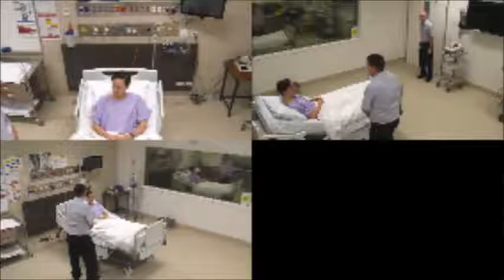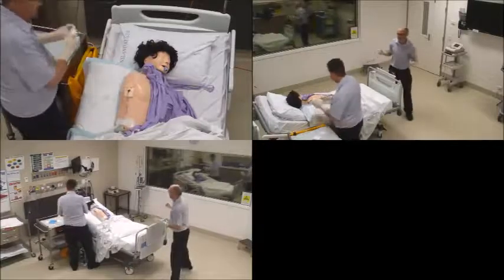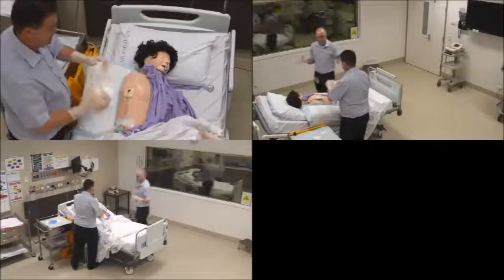The length of time that they've held their breath for is approximately the length of time that they will need to hold their breath for during the removal process. Then ask your patients if they are happy for you to proceed. When you're finished cleaning the area, ensure that your assistant has access to the Steri-Strips and dressing that they'll need once you've completed the drain removal.